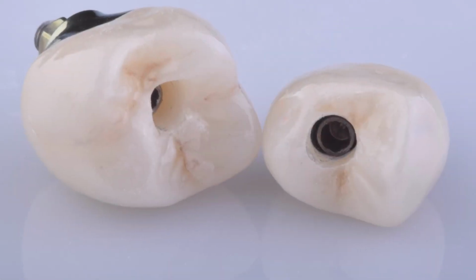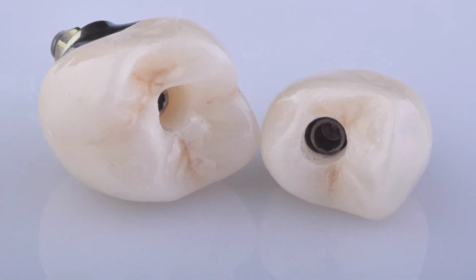And normally what I like doing is using a customized implant crown abutment, and then I just have the lab cement the crown on top of that abutment. You can also use a UCLA type of abutment, and they can create that emergence profile for you. I like using a custom abutment so that they cement the crown, because I feel like that's going to be a lot harder for these two pieces to separate.